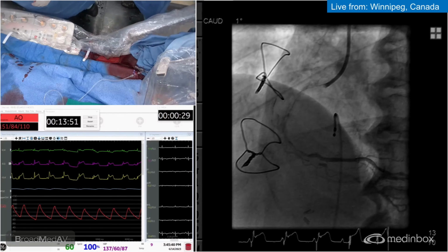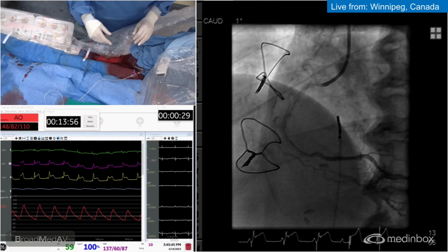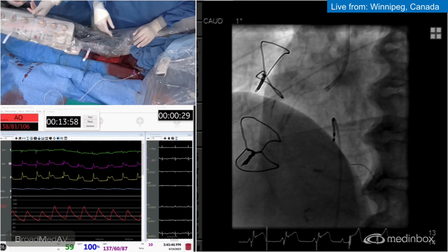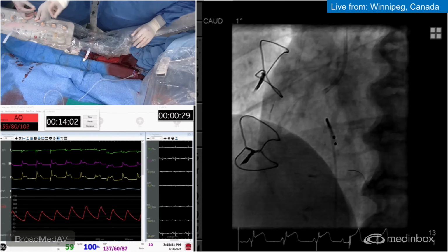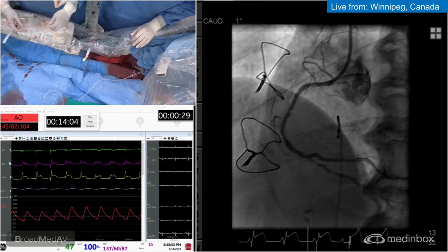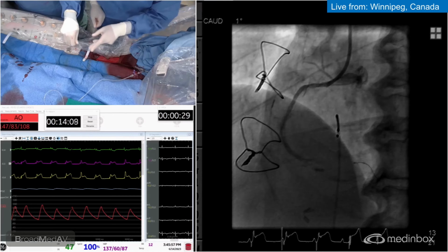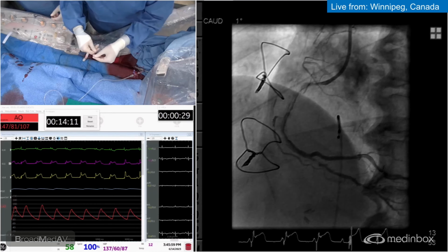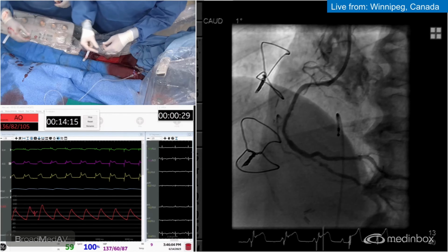Do you want to balloon the PDA? Like get another wire into the PDA? Yeah. I'll take the Beamer in down there and get that going. If the wiring proves challenging because of dissections, we just do a wire exchange over a microcatheter. Give us the wire introducer there, please. I think the PDA we might as well wire it and balloon it, because that's probably where the STs are coming from.